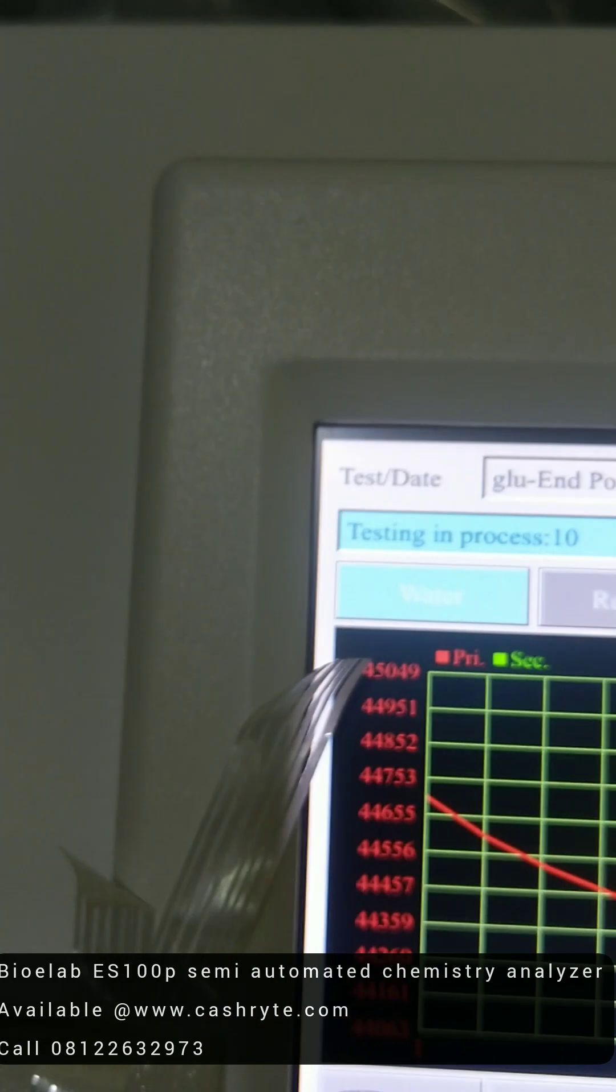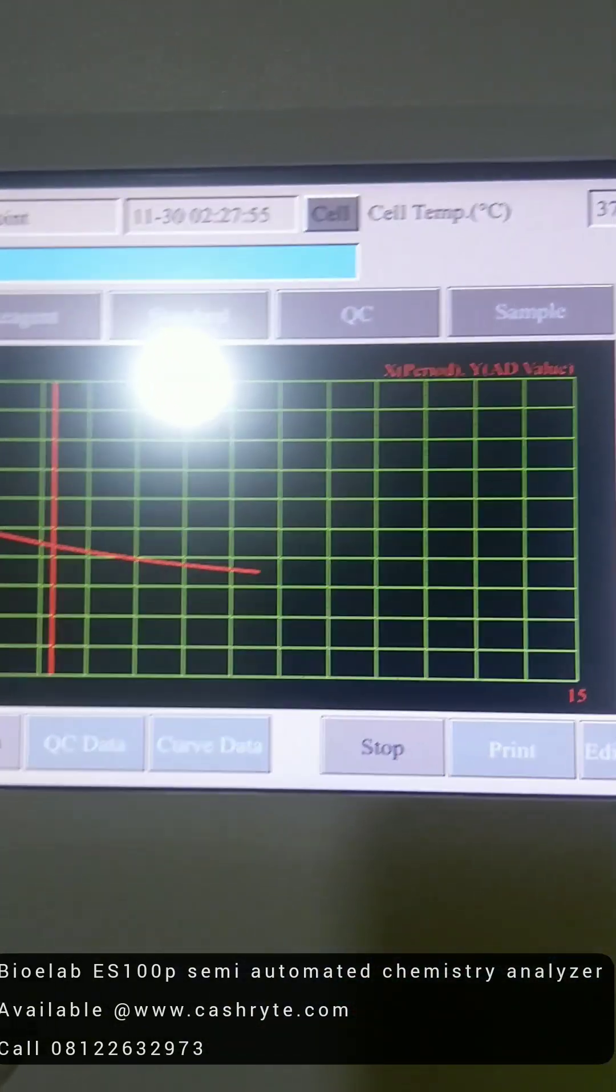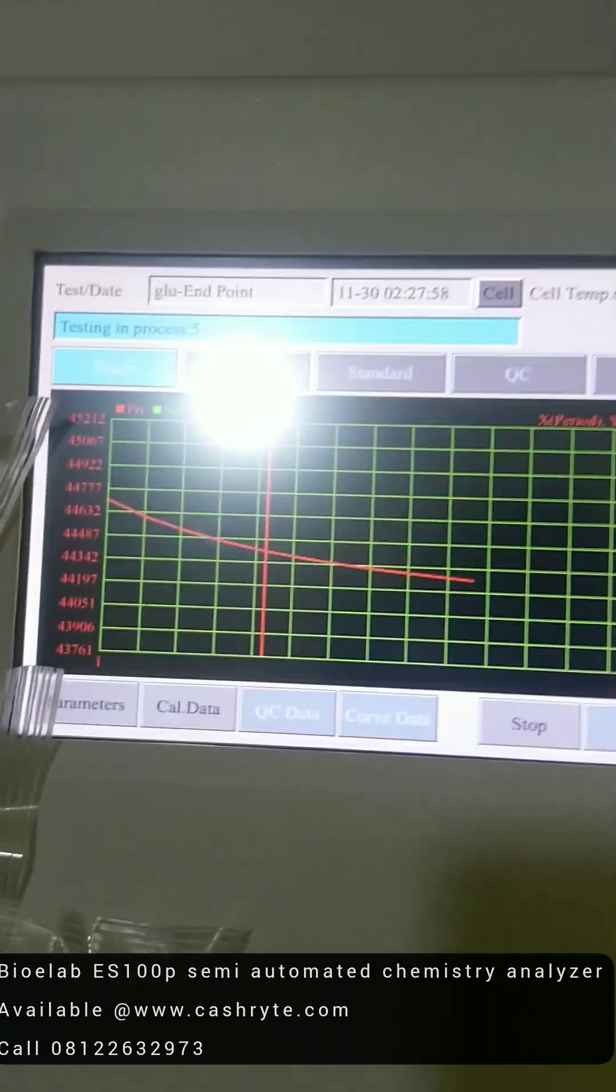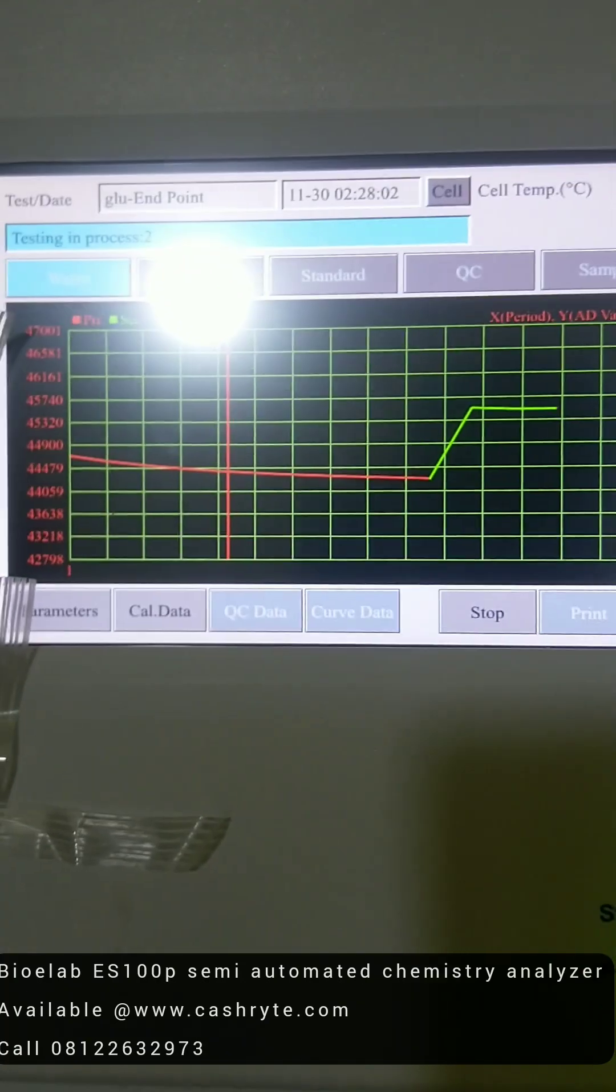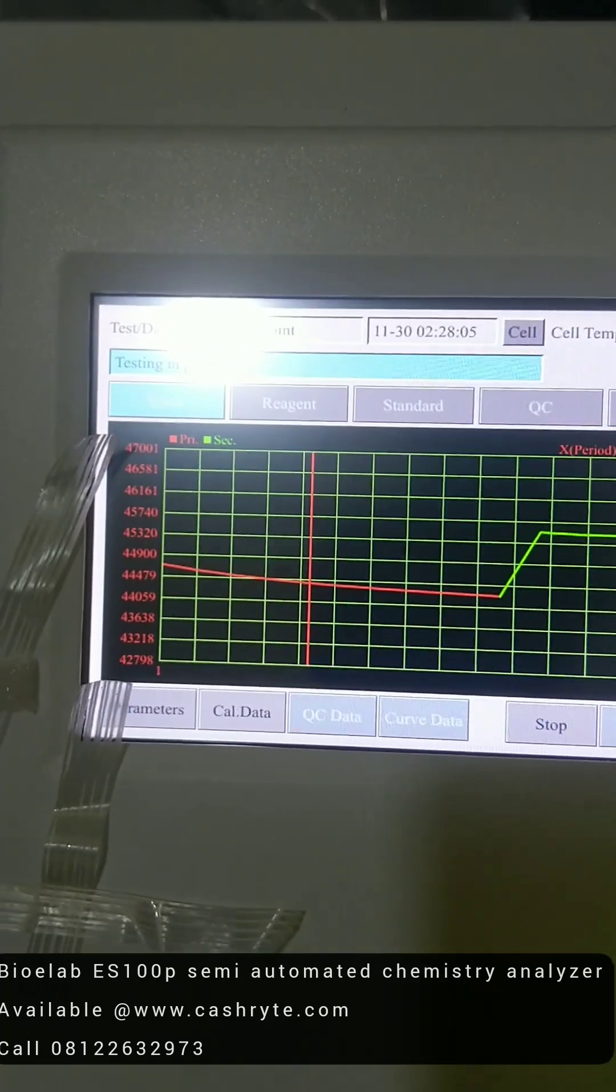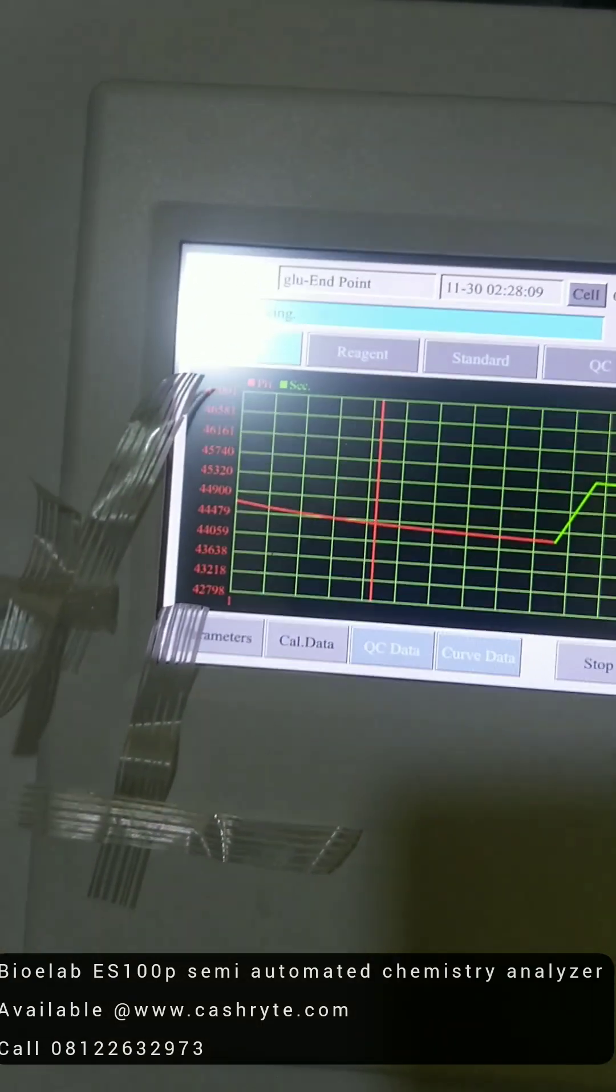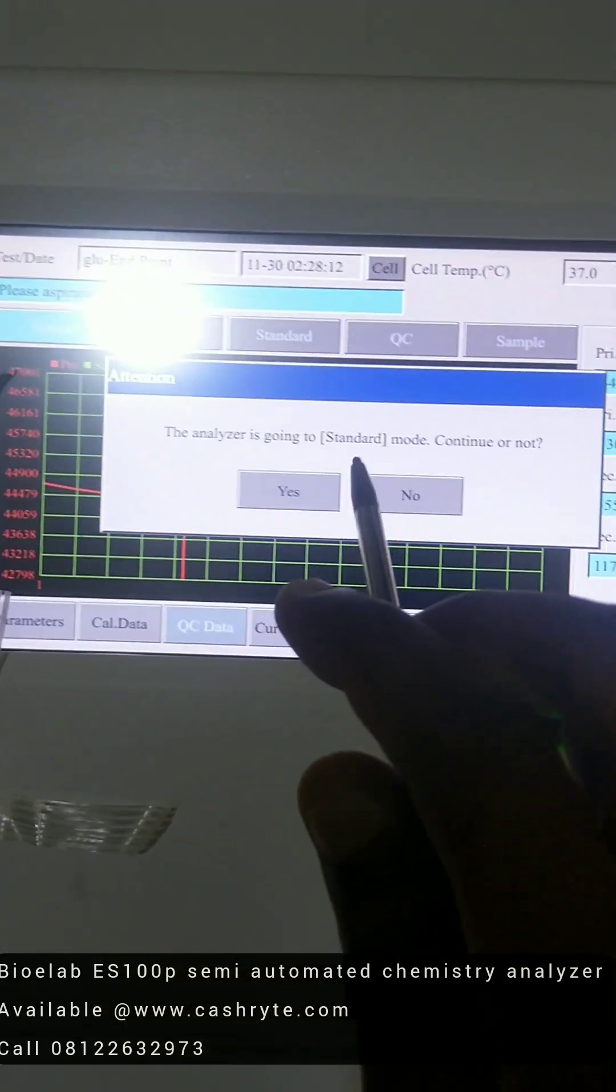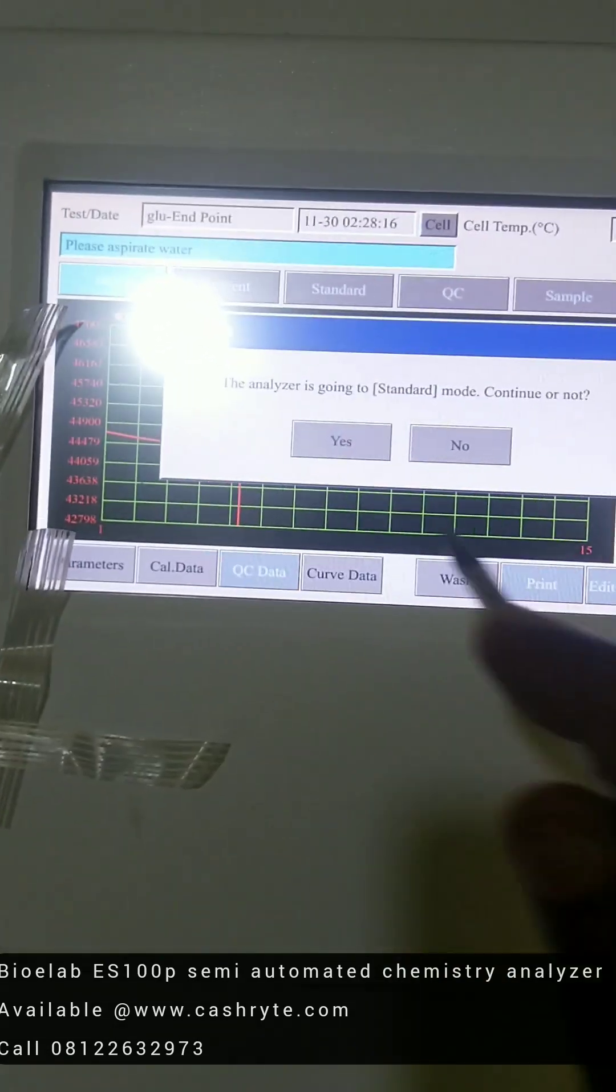So it's in the testing process. So it counts down, you can see the graph. So that's that. So it's telling you test in progress. The analyzer is going to standard mode. That means you have to aspirate standard. This is called calibration.